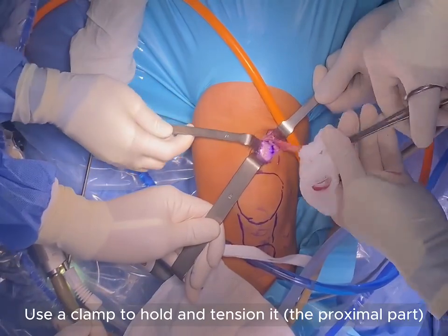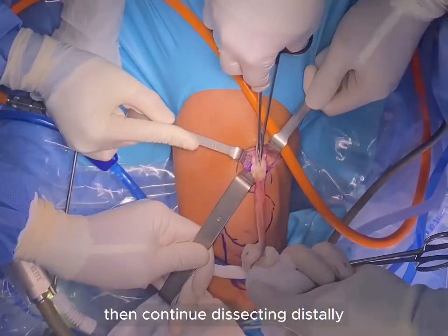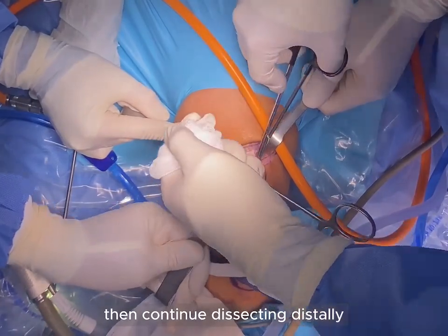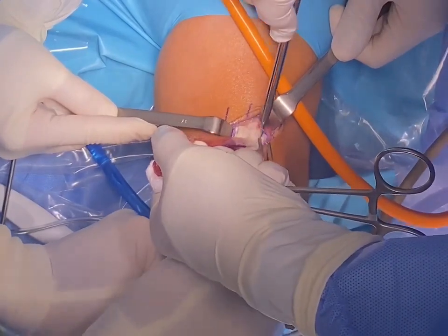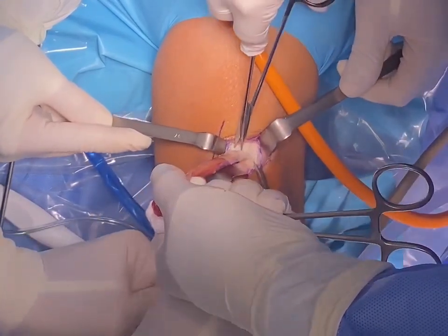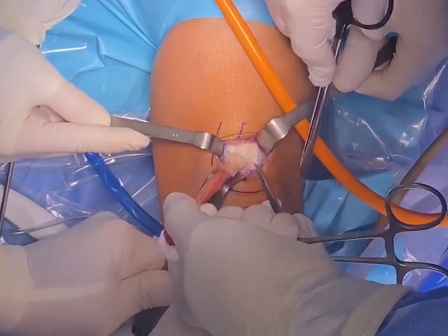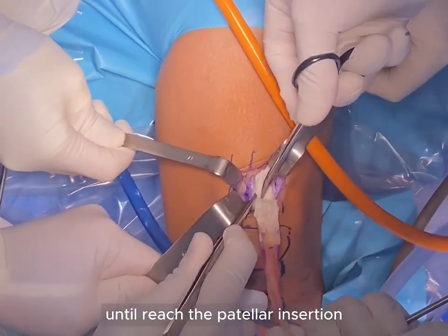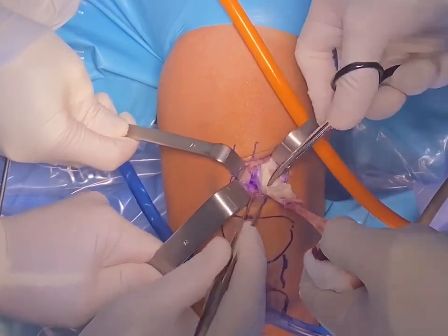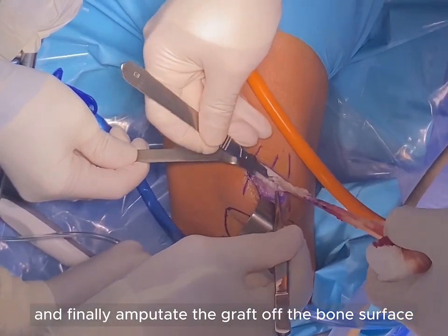Use a clamp to hold and tension the graft, then continue dissecting digitally. Finally, amputate the graft off the bone surface.